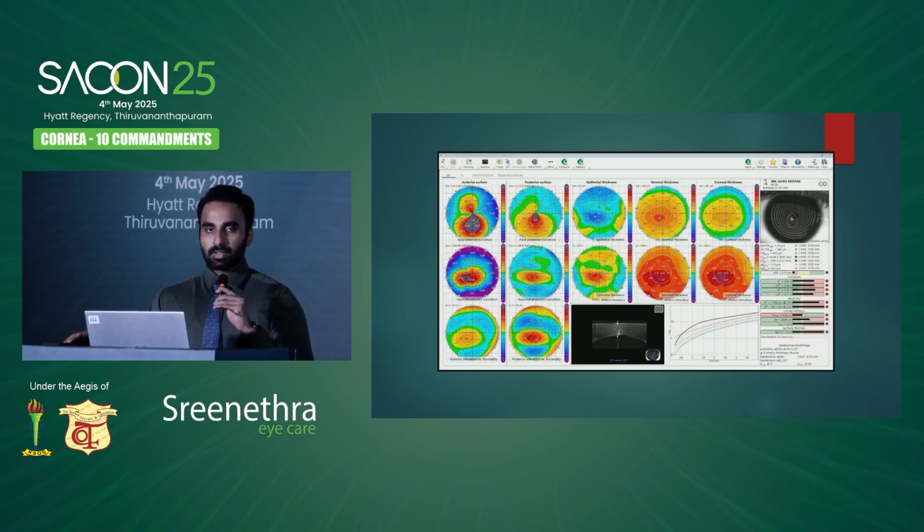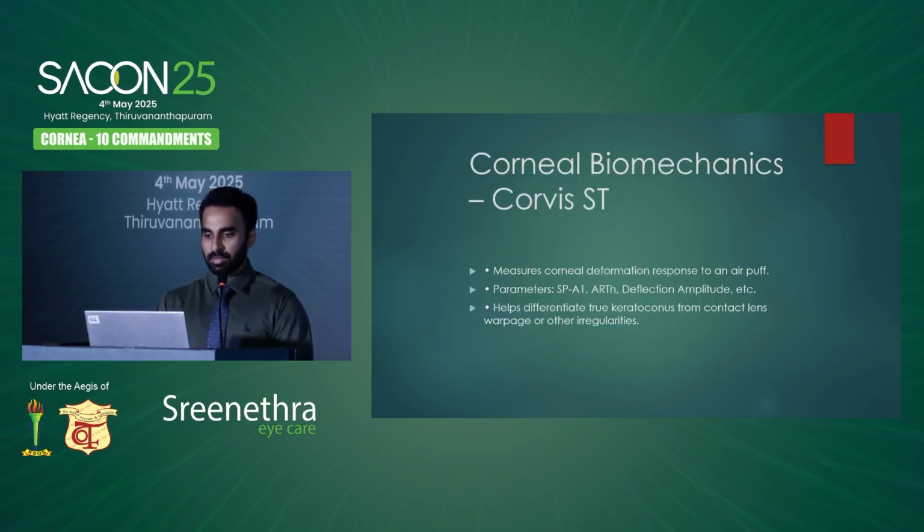If I had just one investigation to look at before I deem a patient eligible for refractive surgery, I can very confidently say it will be epithelial thickness. This is very sensitive, as it even picks up early stages of keratoconus very easily. You can diagnose forme fruste keratoconus, and you can defer corneal refractive surgery for these patients.